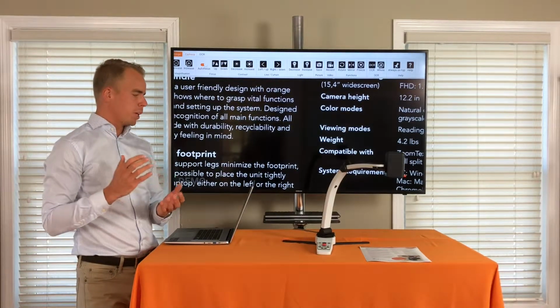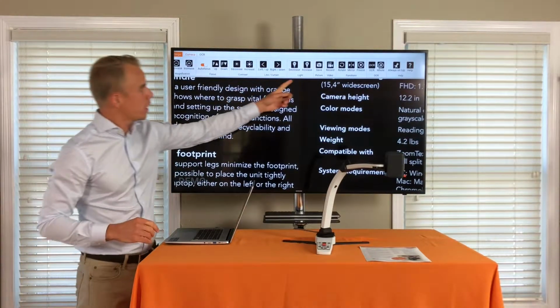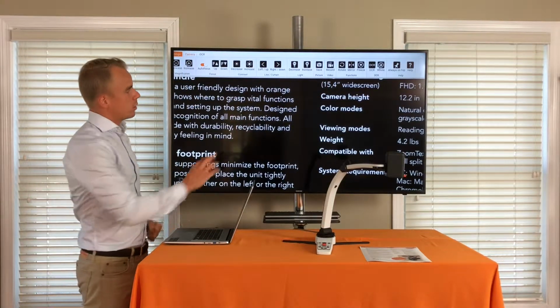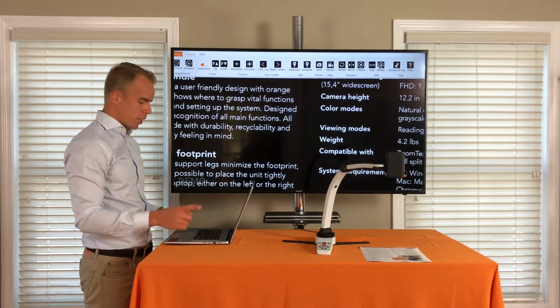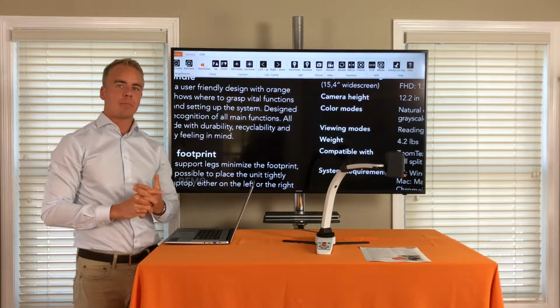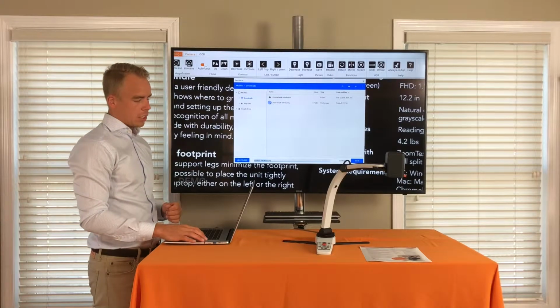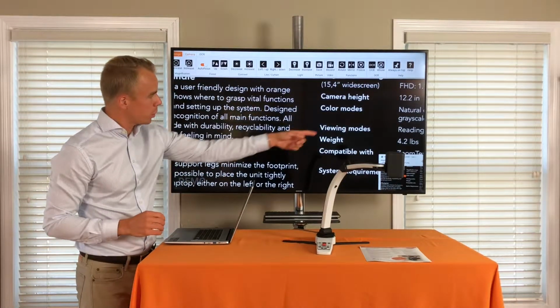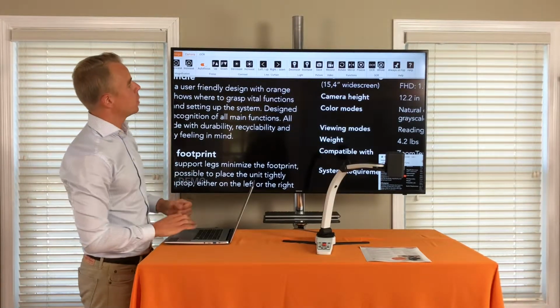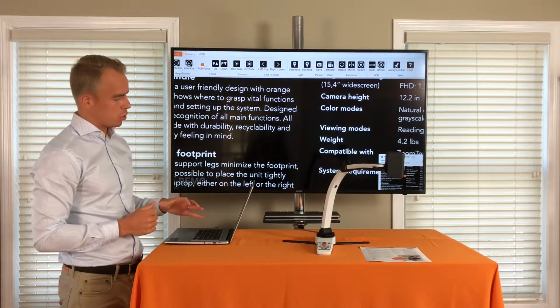A couple of other functions will be how to save images and video record. I can do that either up here in the icon bar where it says picture save and video record. So I simply just press those icons, or I use the short commands, which will be Control P for saving a picture and Control M for saving a video. So Control P, and I just saved what we see on this window into my computer. To open, I do it the same way. They will be stored on my computer, on this Chromebook.